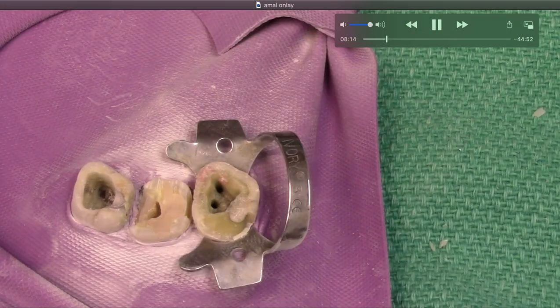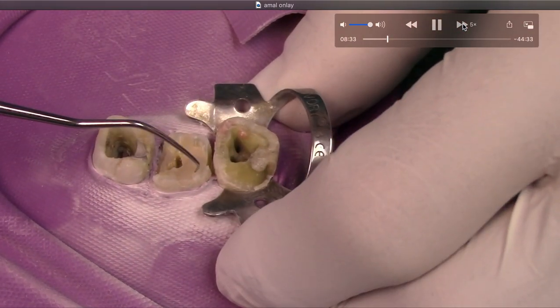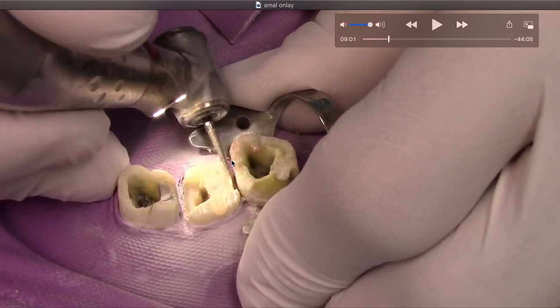We'll take it out and refine everything — smooth all our margins. You can use whatever bur you want. I just had a diamond kicking around, so I'm using that to round off all the corners, as we discussed in the overview. We're going to round everything off and make sure we don't have any jagged edges. We want this to be smooth and flowing — not flat across — and we want to get rid of any jagged edges.